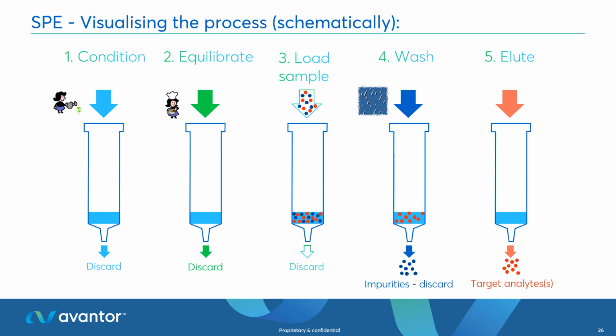What we then do is apply a wash step. This is where we try to remove as much of the matrix as possible. The typical approach will be to look at a slightly stronger eluting strength wash solvent that elutes our matrix components, or some of our matrix components, but doesn't elute the compound. And I can talk through how to optimize that later on.